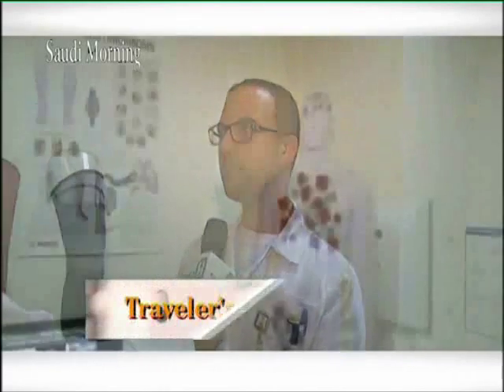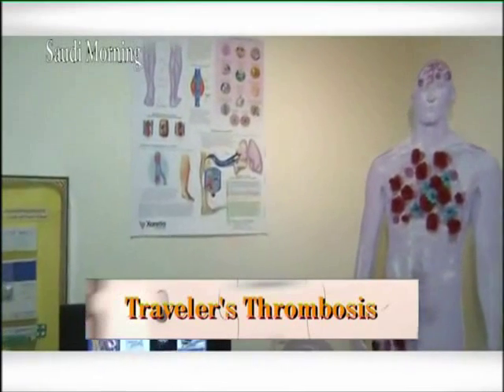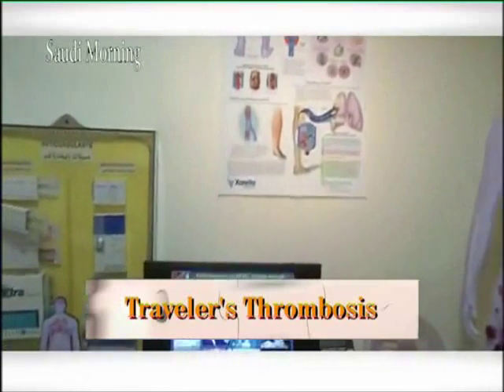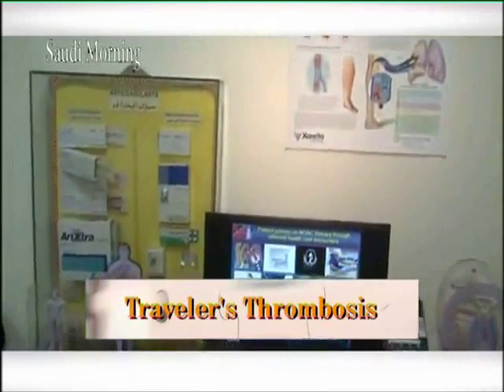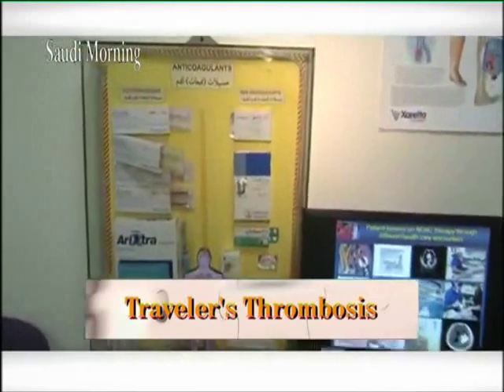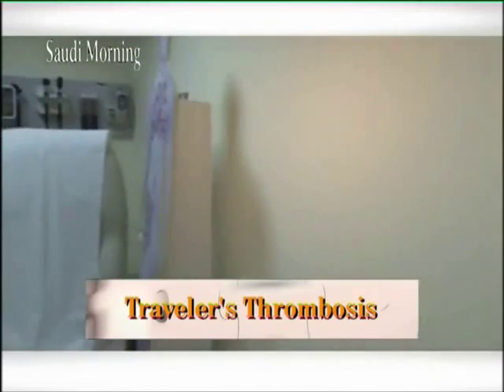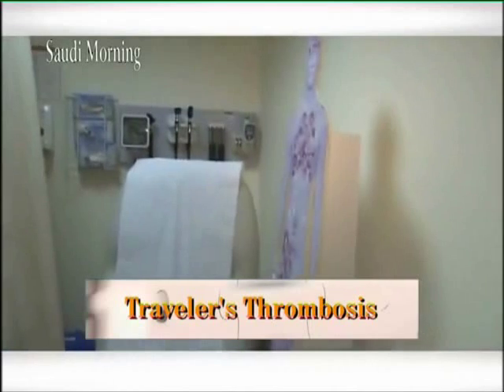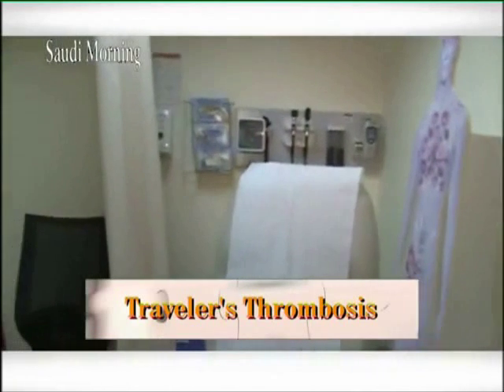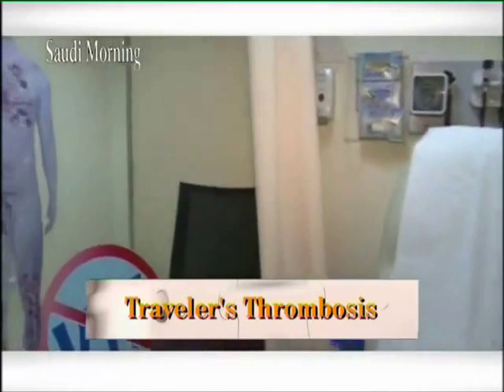Physical therapy is one of the specialties that deals with many cases, especially in the thrombosis team. We are part of the team. Not only a physical therapist, the therapist should be a certified lymphedema therapist in order to issue for the patients the proper stocking or pressure garment that the patient needs after he takes the proper medication and is referred by the physician.